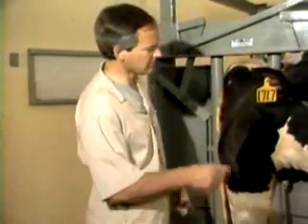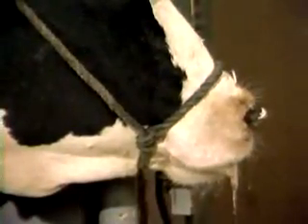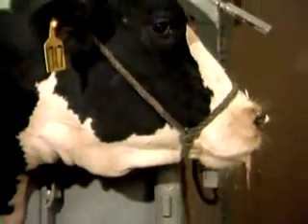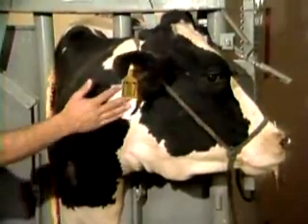The first essential thing is to make sure the head is restrained properly. She has her halter tied very tightly and she also has a nose lead which has slightly less tension on it. Hold around to the side and get as much leverage there as possible, because a cow like this one that's had a lot of medication begins to react as soon as you touch her.